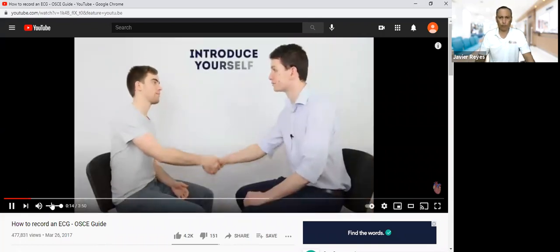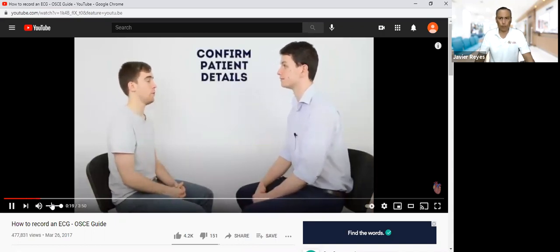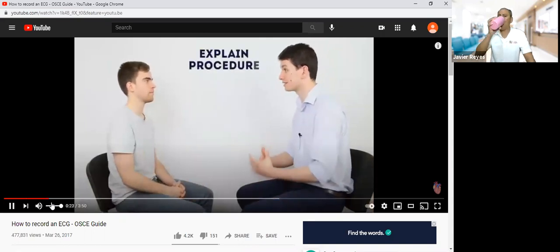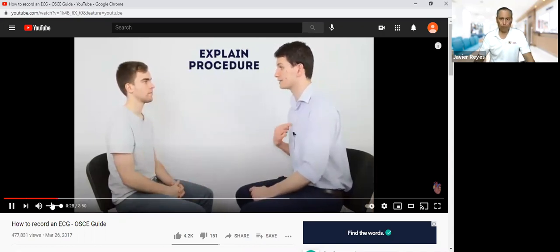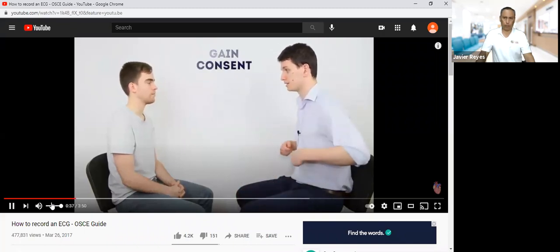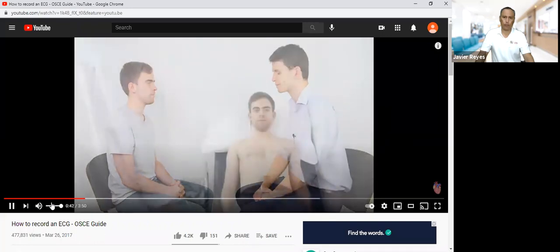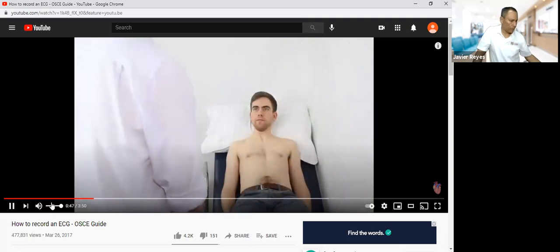Hi there, I'm David. I'm one of the medical students. Thanks for coming in today. Can I just confirm your name and date of birth? Sure, it's James Alexander, 13th of December, 1989. Okay, James. I'd like to do an ECG today. It's an electrical tracing of your heart. It's going to involve me placing some sticky pads on your chest, arms and legs and measuring the electrical activity of your heart. Would that be okay? Yeah, that sounds fine. For this, I'm going to need you to take your top off and just lie down on the couch for me. Is that okay? Are you comfortable where you are? Yes, I am. Do you have any pain in your chest at all?